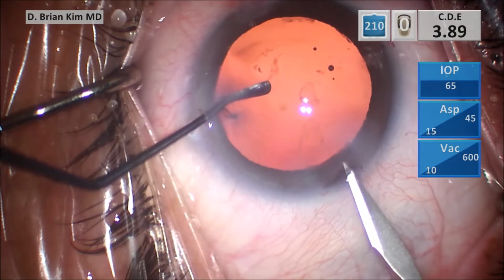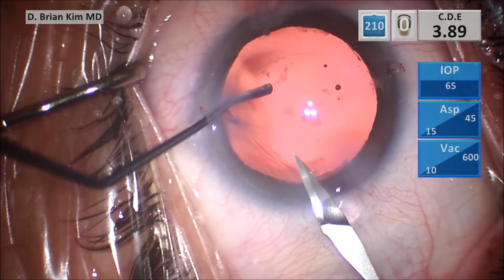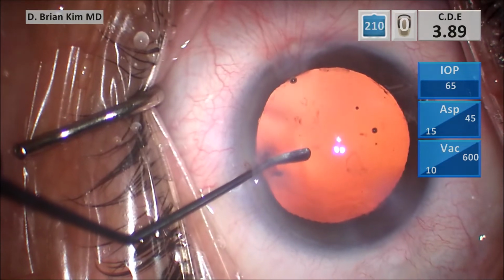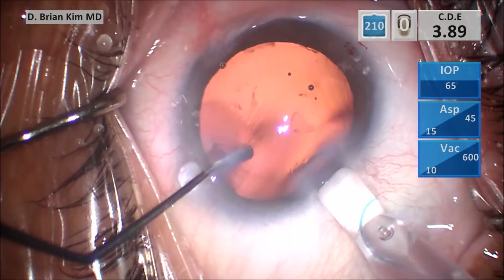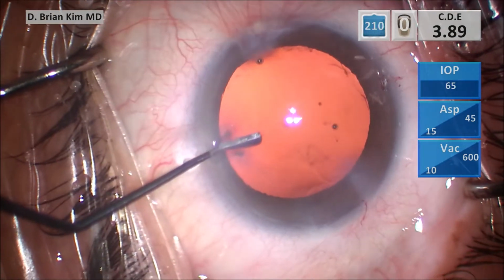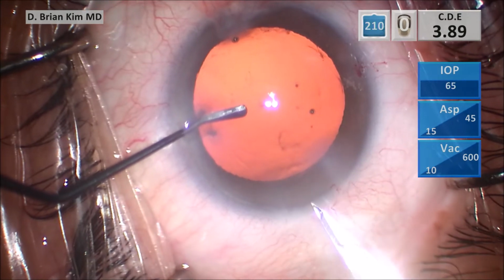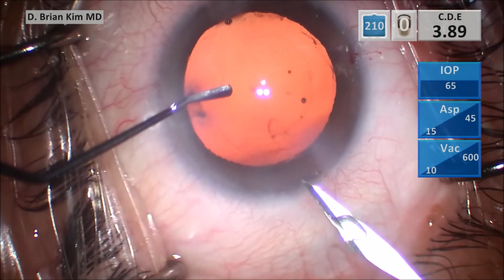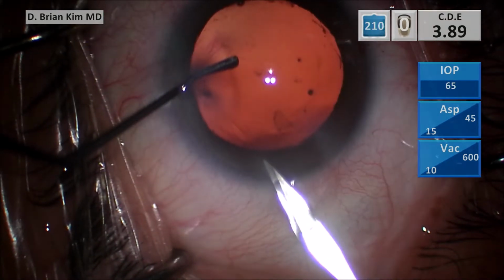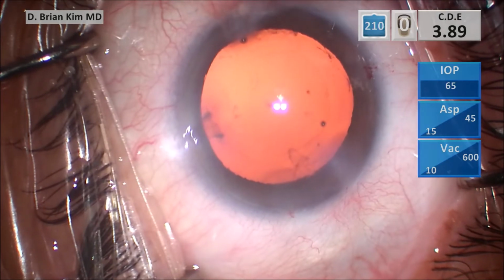This is a fairly dense lens, and as a result, I decided to put in a 3-piece lens. I'm going to widen the incision with the blade here, and I go in with the injector, bevel down. You can see when you're widening the incision, sometimes it's still a little bit challenging to get that injector in. So I go ahead with the blade one more time, and I widen the incision. Remember, every time you try to forcefully get the injector into the incision, you're going to have potentially OVD egress. And so you have to be mindful of filling the capsular bag again as needed in these situations.